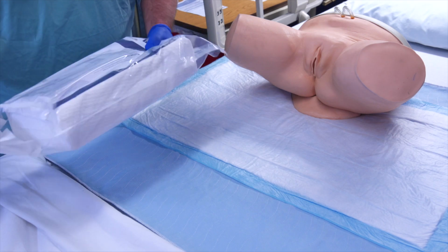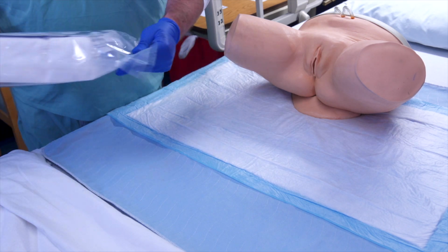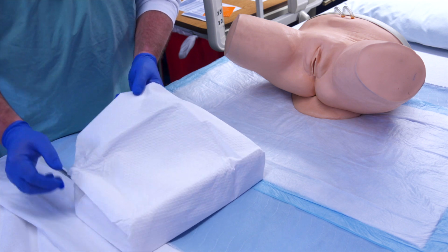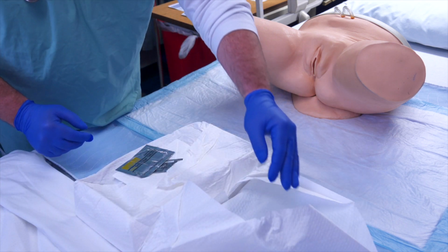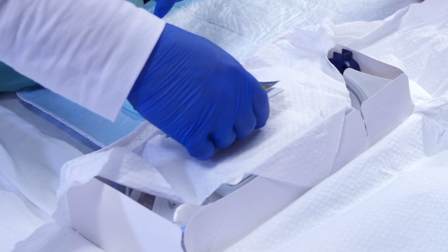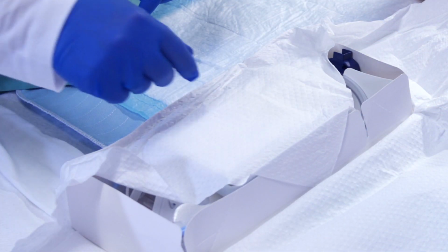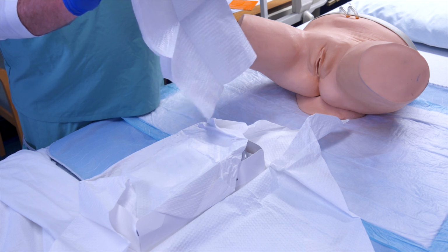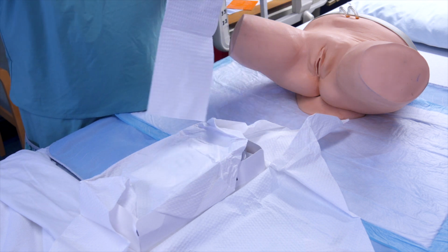Open the plastic wrap and remove the Foley kit. Place the tray between the patient's lower extremities. Open the outer CSR wrap away from you so that you're not leaning over the sterile field. Remove the Castile soap and hand sanitizer and set them aside. Open the inner layer and remove the top drape, holding the back corners, and slide it under the patient's perineal and hip area.